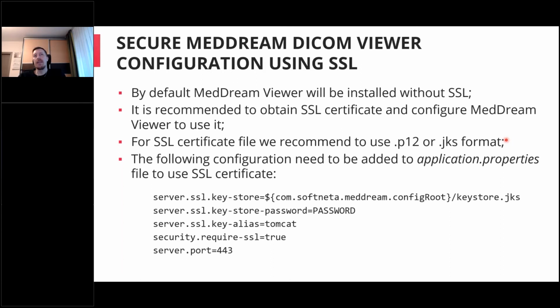For the certificates, we recommend using P12 or Java keystore formats and adding them to the desired location.